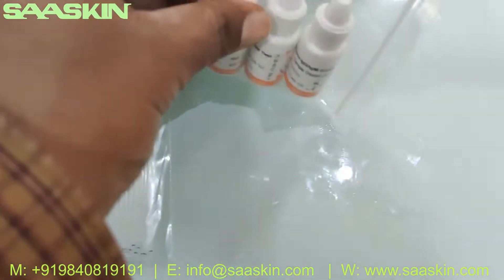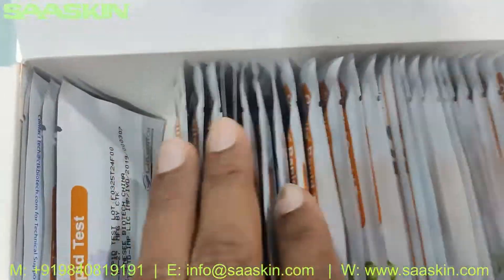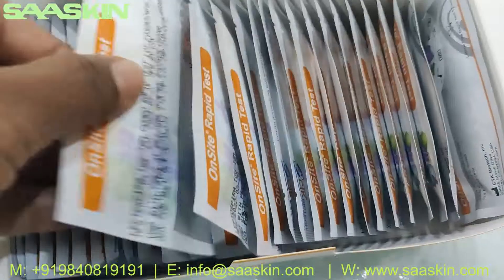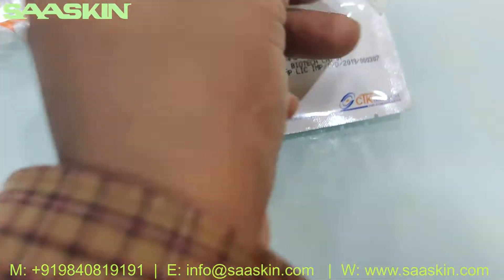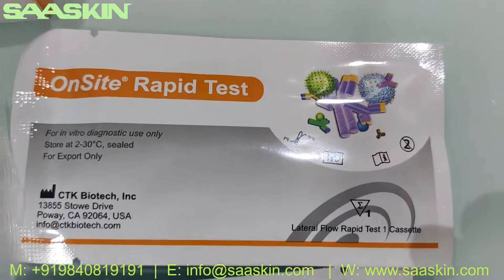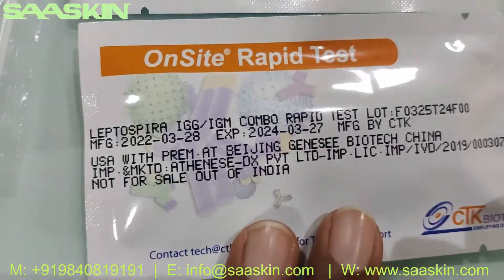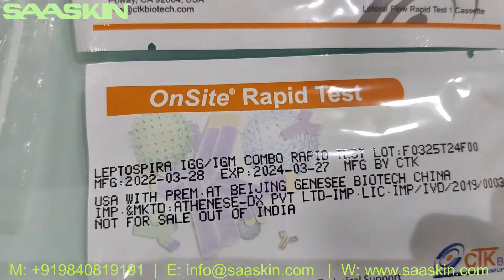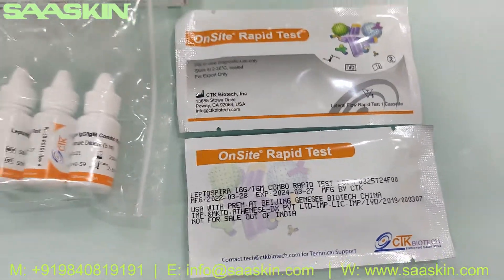This is the assay diluent buffer. And you can see the test cassettes here — there are 30 test cassettes. Let me take out 2 test cassettes so you can see them. This is the standard cassette, and here you can see the Leptospira IgG IgM Combo Test Kit labeled on it.